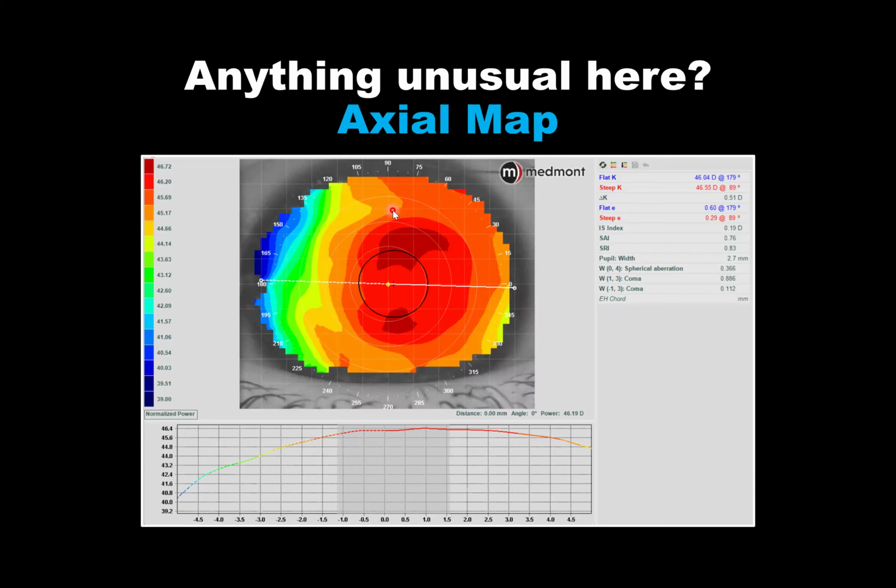Si tenemos un mapa como este, que no es un mapa totalmente común, sabemos qué es lo que está pasando en esa área, pero quizás el mapa axial, que es el que tenemos acá, no es lo suficientemente sensitivo para poder decirnos a nosotros qué está sucediendo. Y entonces, pues hay que trabajar con los mapas.